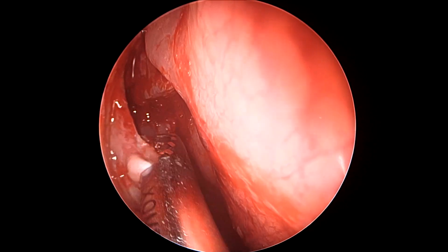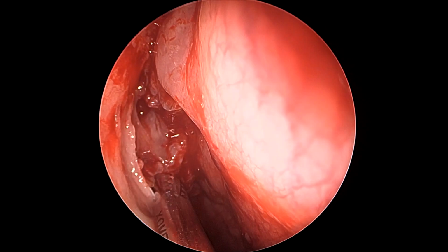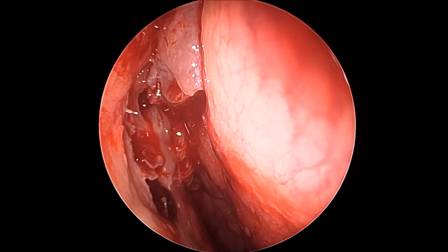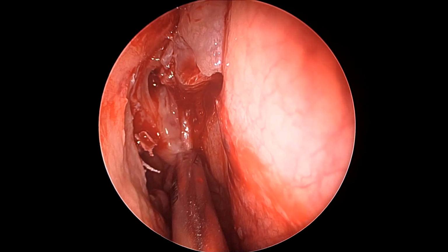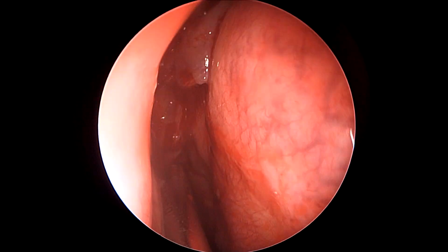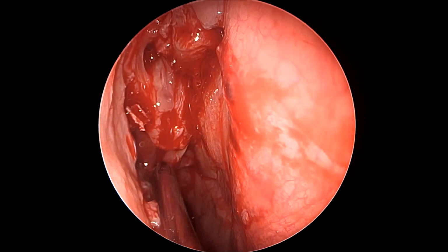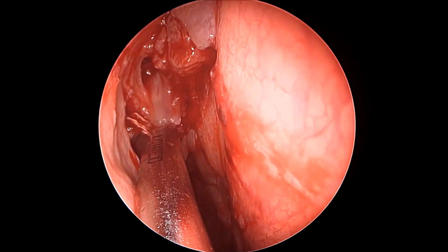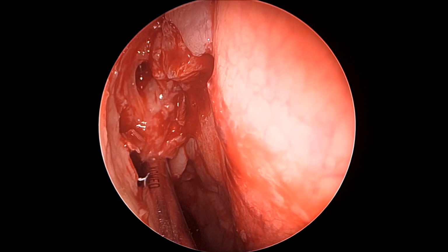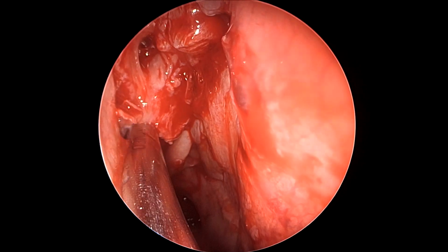Before proceeding into further sinuses, it is important to remove the redundant mucosa and some of the anteriorly placed polyps before we can make sense of where the approximate location of the ethmoids and the maxillary sinuses is. Before we progress to the ethmoids, we strongly recommend that the maxillary sinus be widely opened. A good, generous, wide antrostomy in polypoidal disease not only helps the surgeon keep perspective of the trajectory of the sinus surgery, but also helps in preserving landmarks. How so, we will shortly discuss.